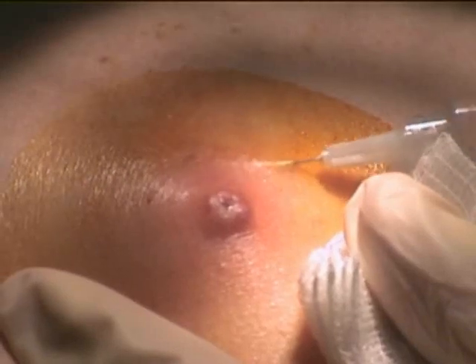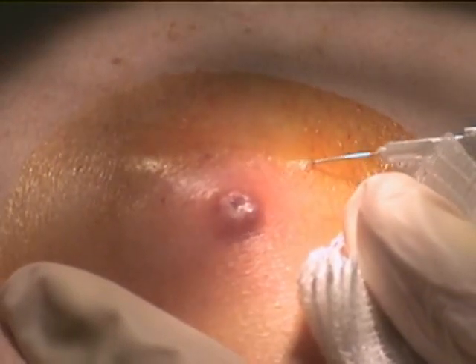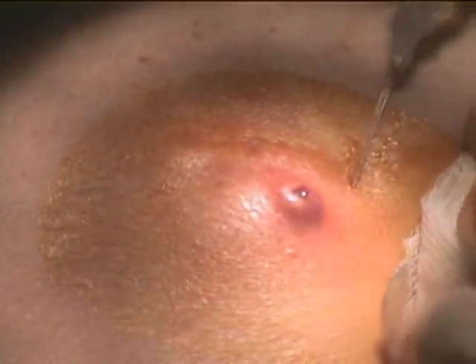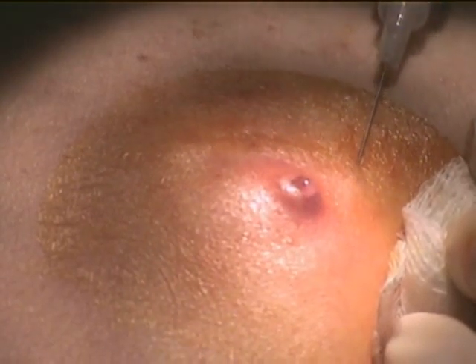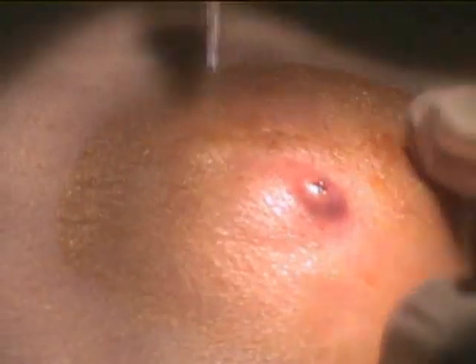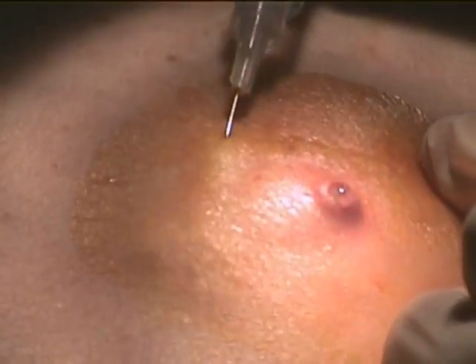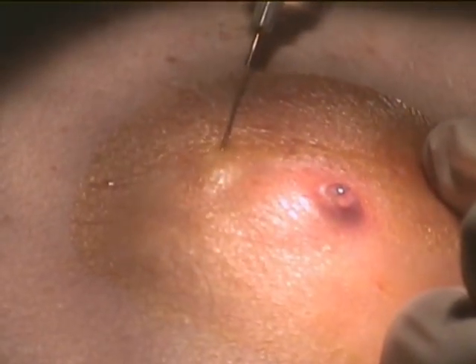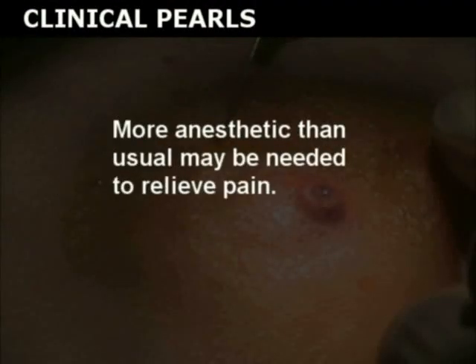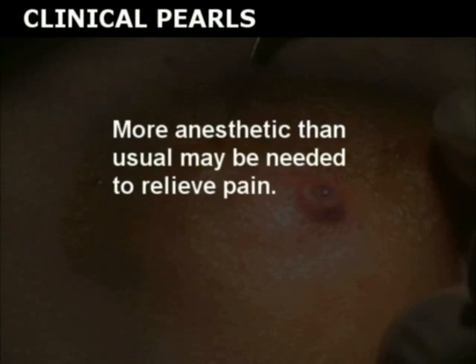Administer a field block with local anesthetic to allow an adequate incision to be made. Avoid infiltration of the abscess cavity; concentrate on anesthetizing the perimeter of the tissue around the abscess. Note that local anesthetics are less effective in the acidic milieu of an abscess, so more anesthetic than usual may be needed to relieve pain.